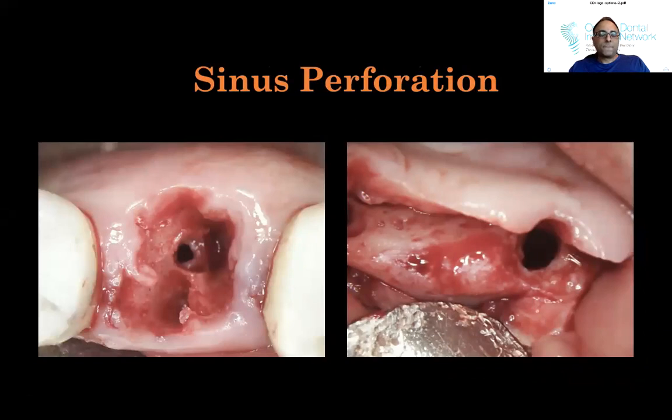Sinus perforation can happen also when we're placing an implant. So you can see here's a minor sinus perforation while I was doing an immediate. This is a larger sinus perforation from a failed implant.